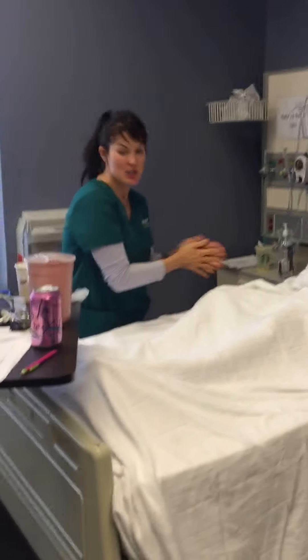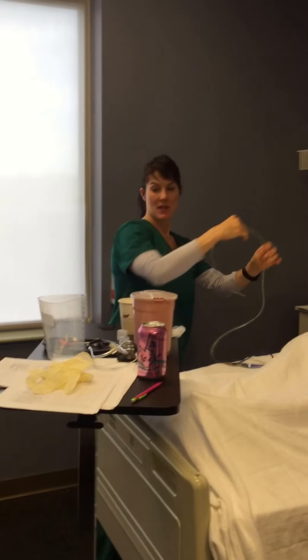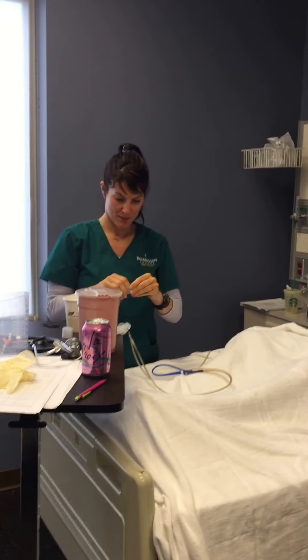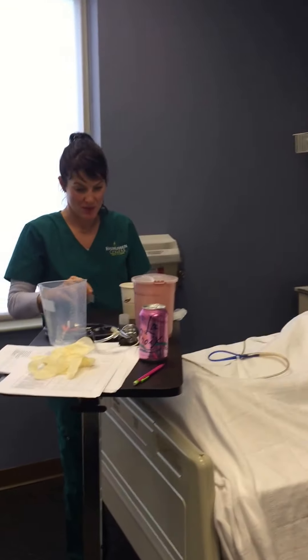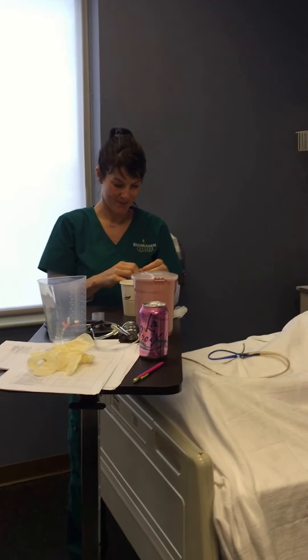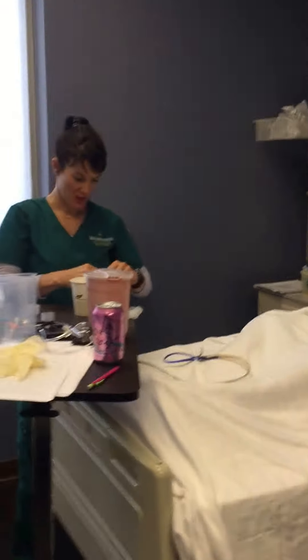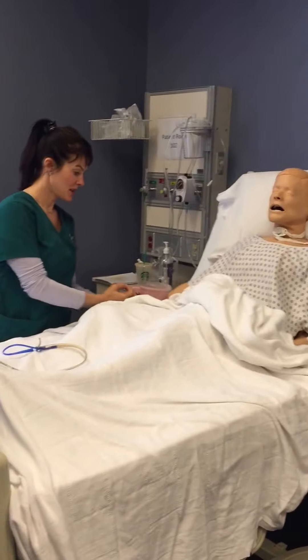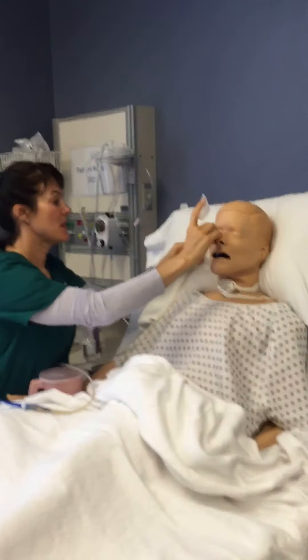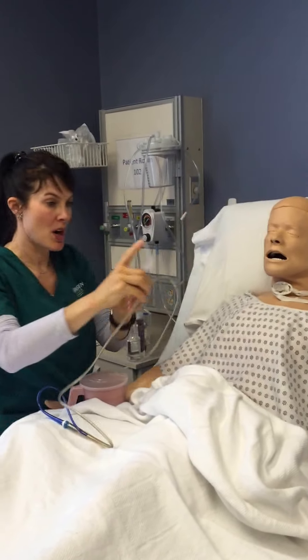So I've got some hand hygiene. First things first, I'm going to measure the tube. I'm going to use a gastric tube. Check the pH — it's all good. I'm going to measure my nasal gastric tube from the nose to the earlobe to the xiphoid process. I'm going to mark that with some tape.